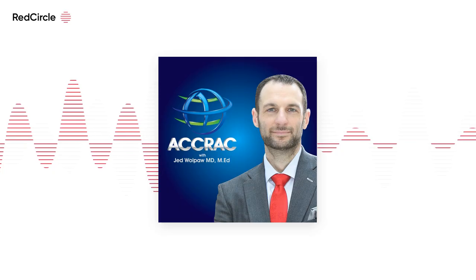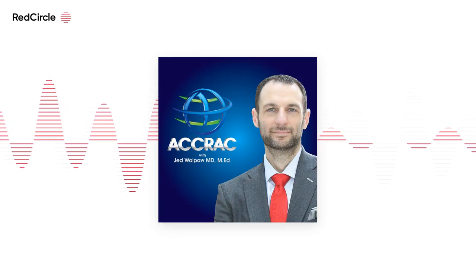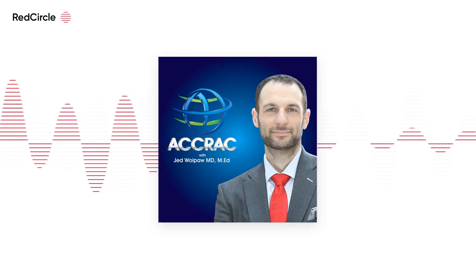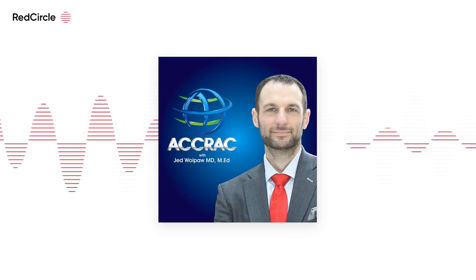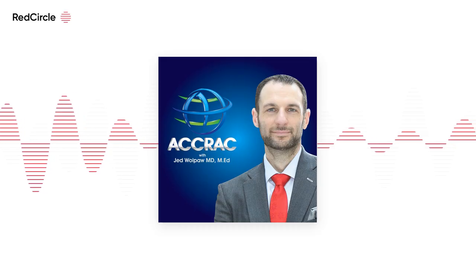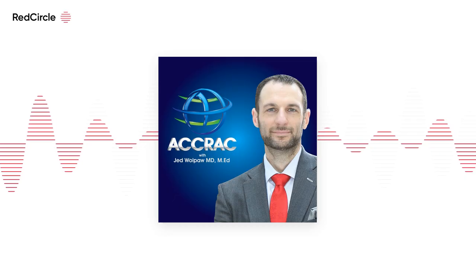This does mean it shouldn't be used with, for example, active pacemakers, just because there's interference with the EIT signal, so your EIT signal may be affected. It's an electrical signal sent through pairs of electrodes. Your device is either going to have 16 electrodes or 32, depending on the brand. In terms of popular brands in the world, Pulmovista by Draeger has 16 electrodes. In the US, I think you only have the Timpel available, which has 32 leads.